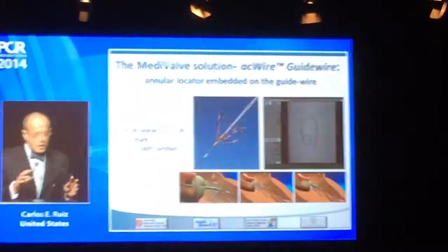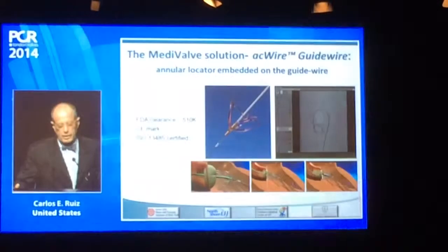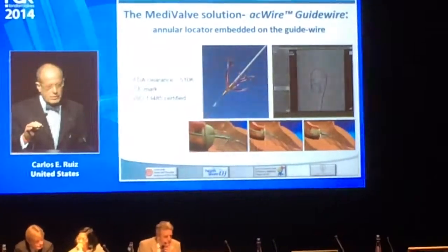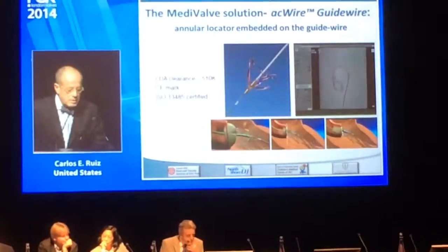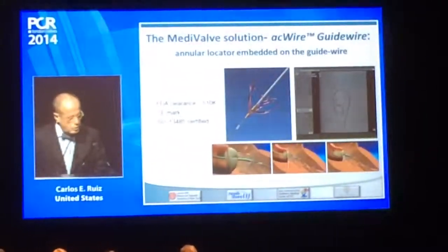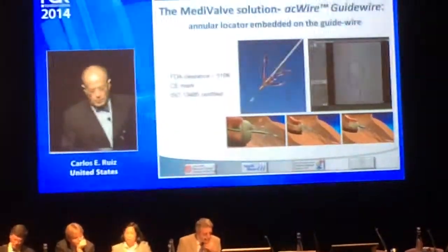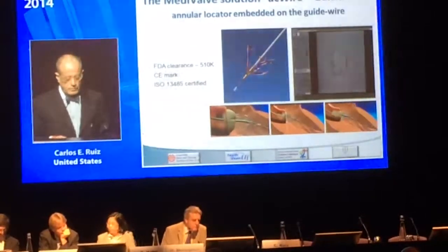Now, not everybody has this technology. And do we really need that co-registration and fusion to be able to deploy the valve at the right place? Well, there is a new technology that has just recently been approved by the FDA and also by the CE mark. There is a simple wire that has 3 loops, and basically that is the wire that is used for the deployment of the TAVI.